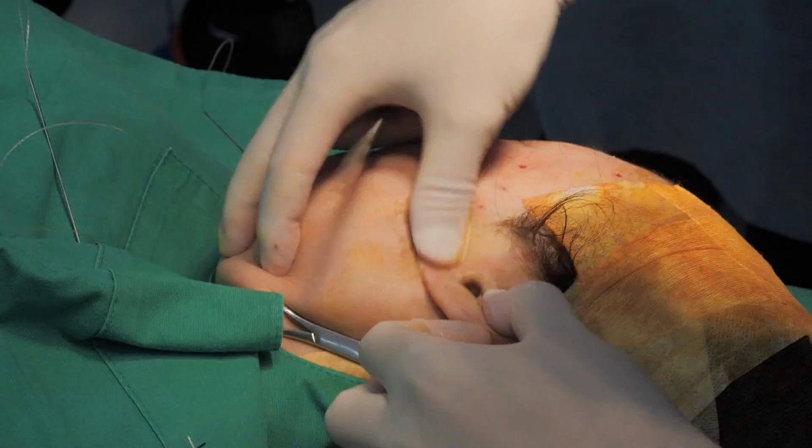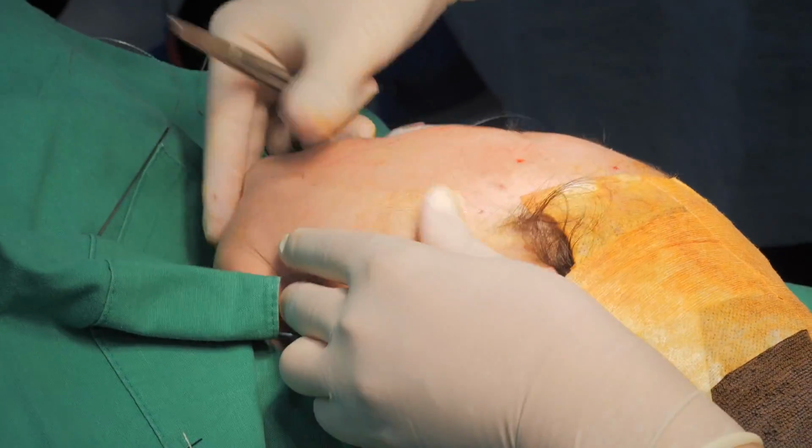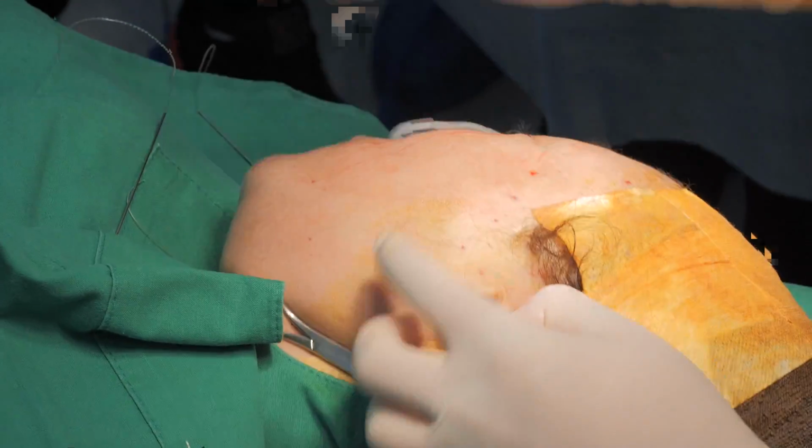You should release the dimpling with mild massage.